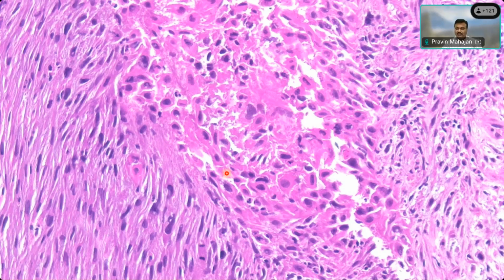Does it help in making the diagnosis clear without doing IHC, Anugrah? Will that help you? Yes, this really helps. So, as I told you, looking for some island like that or looking for a surface epithelium which has dysplasia or squamous carcinoma in situ, or an area which shows this epithelial morphology, makes your life very easy and you can definitely say this is a sarcomatoid or spindle cell squamous carcinoma. Okay.